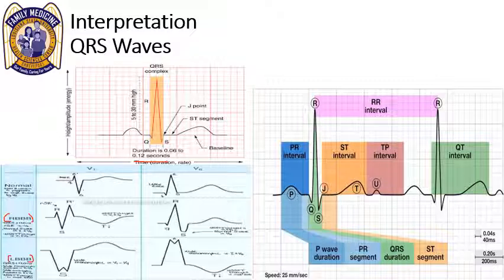So that's the QRS complex. Bringing it over here, remember, P waves upright, how long is the PR interval, and then you go into the QRS: is it wide or narrow, is it regular or irregular? Those are the two questions that you ask.